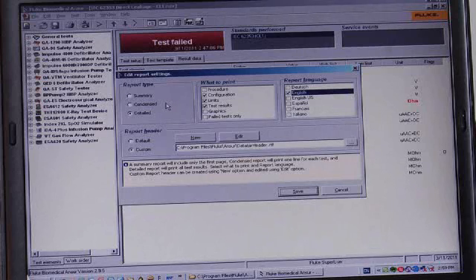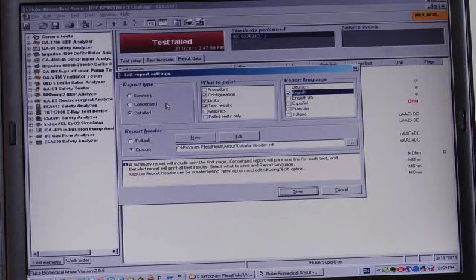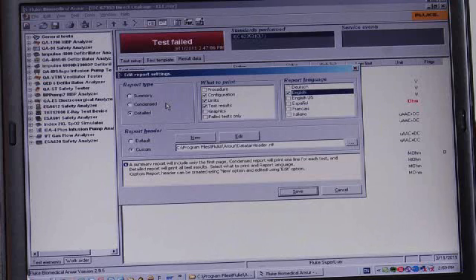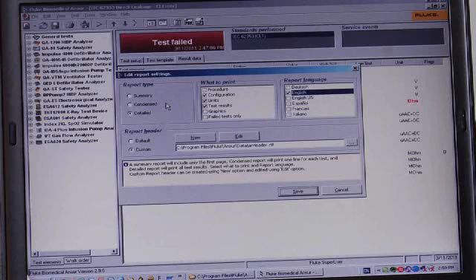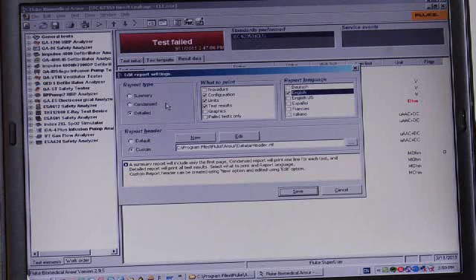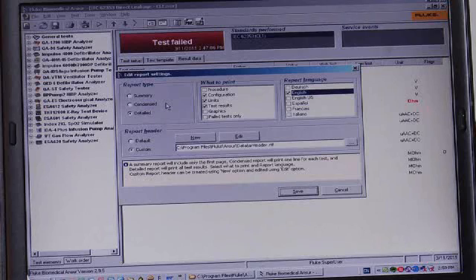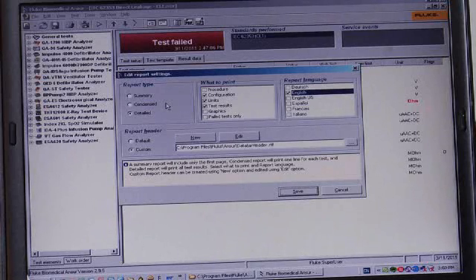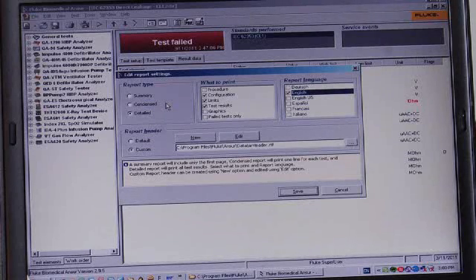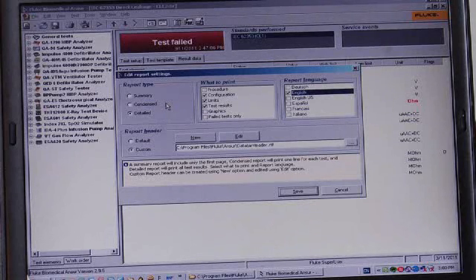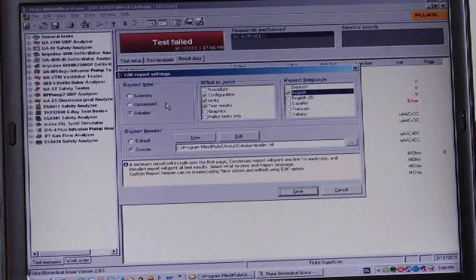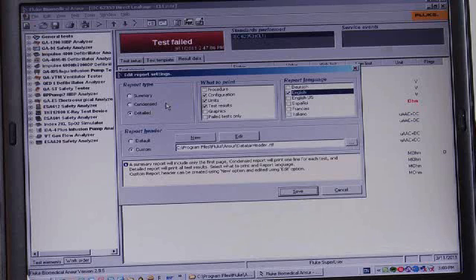Now we could include the test procedure, which is exactly the explanation of what it was that we were supposed to do in this test, as well as the test configuration, the testing limits and the test results. Graphics are not applicable in electrical safety testing, but they are in other kinds of testing that we do with this software. And we certainly don't wish, at this time anyway, to print failed tests only. We will not select the test procedure, but only the configuration, the testing limits and the test results.